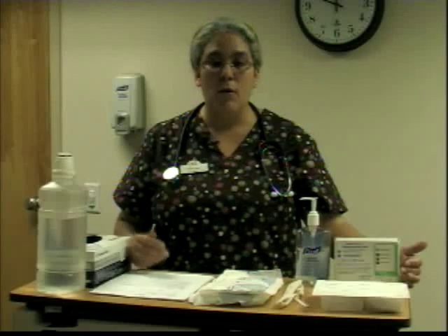Basically, I'm going to give you a little background information, give you something to start working in the back of your mind, and then I'm going to give you a demonstration of both of them together. When it comes to tracheostomy care and suctioning, at the beginning of your shift, most likely you're going to perform both of them together, one after the other, of course. And then the suction is the one you will be performing throughout your shift as needed.